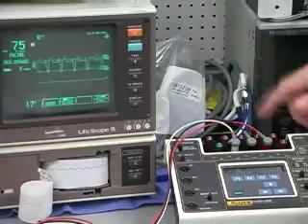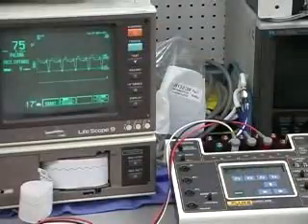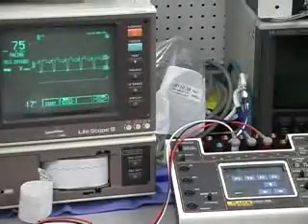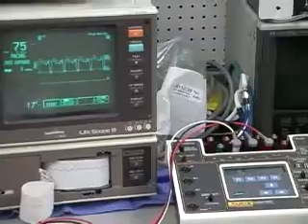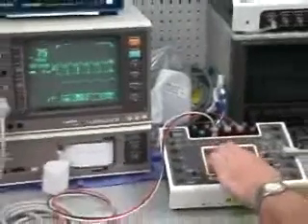In this case, it's negative going, so it's beginning to grow. And as soon as it gets a little bit larger, you're going to start getting a little bit of a double beat. So basically all I'm saying is it gives you the ability to run the different parameters.